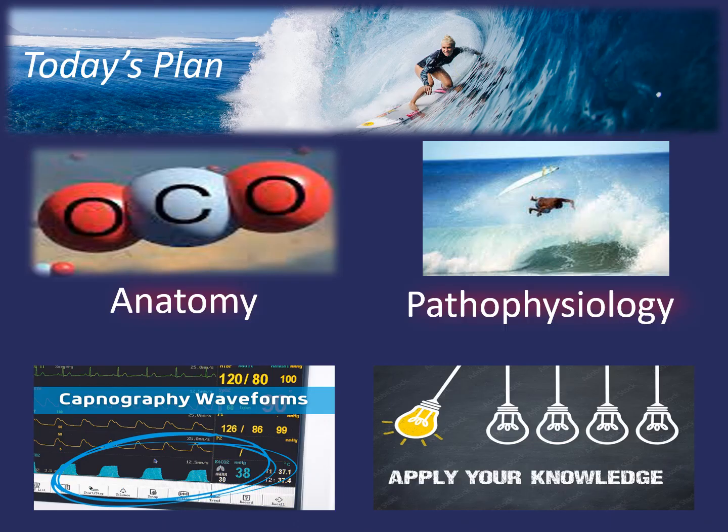Everyone's pretty familiar with pulse oximetry and the instant feedback it provides about oxygenation. The airway, breathing, and circulation, the ABCs of a patient, can rapidly be assessed using the capnography waveform and end-tidal carbon dioxide values. So today we will be looking at the instant feedback provided by waveform capnography and the information provided about the patient's ventilation, perfusion, and cellular metabolism.